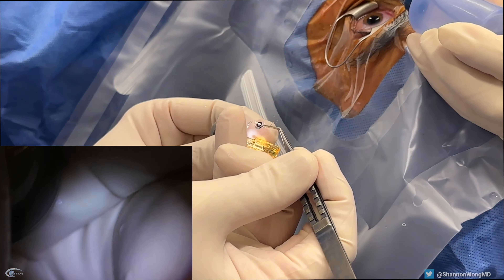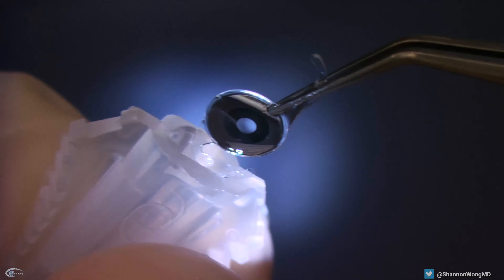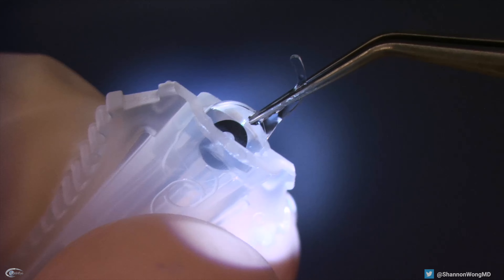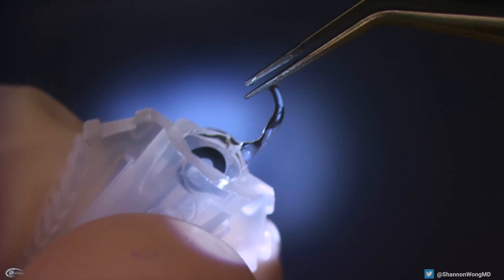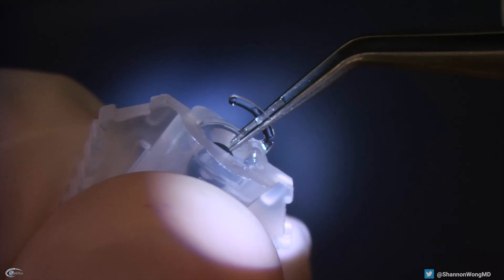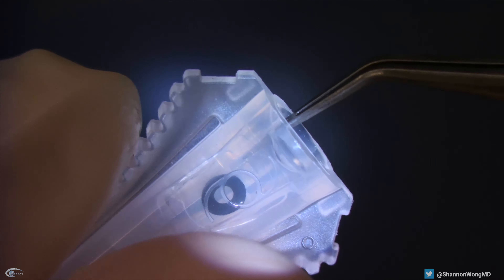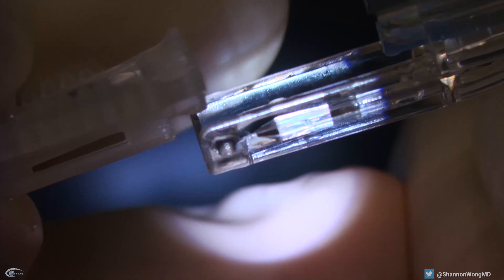We then insert the IC8 into the lens cartridge, which has been filled with viscoelastic. The Bausch and Lomb representative advised us to have the leading haptic fold over the lens optic, and then to ideally have the trailing haptic placed over the optic as well. So we tried this maneuver. The IC8 is then advanced into the cartridge using smooth forceps. The lens cartridge is then placed via a tongue-and-groove fit, and confirmation of proper docking is confirmed when we hear an audible click.